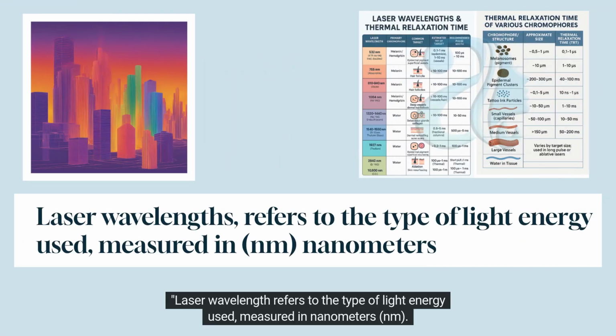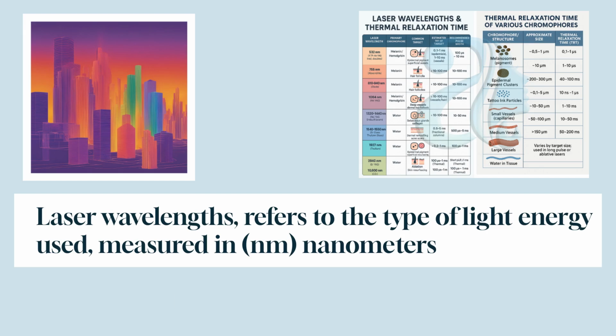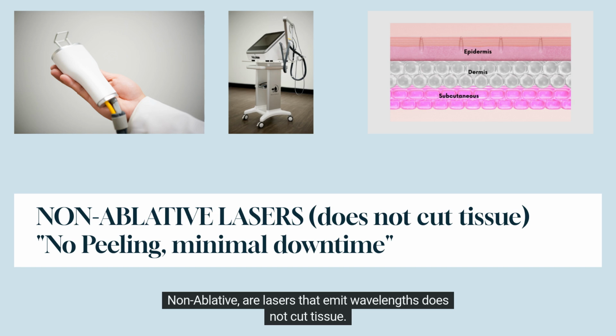Laser wavelength refers to the type of light energy used, measured in nanometers. But what's more important for clinical results is whether it's non-ablative, fractional ablative, or fully ablative. Non-ablative lasers emit wavelengths that do not cut tissue.